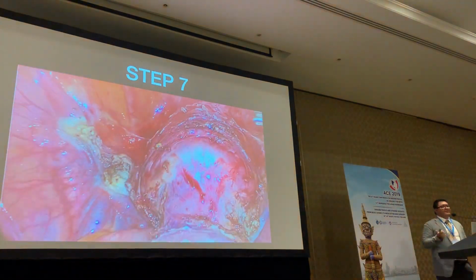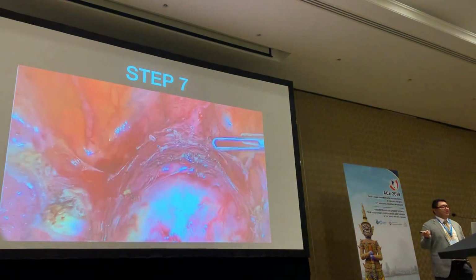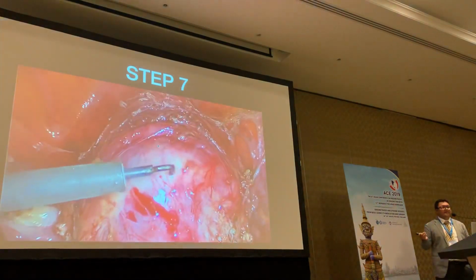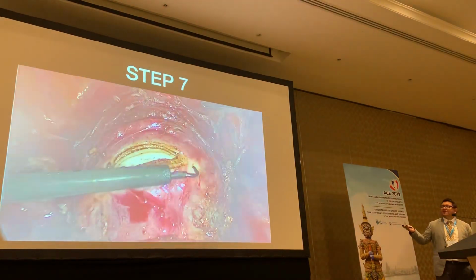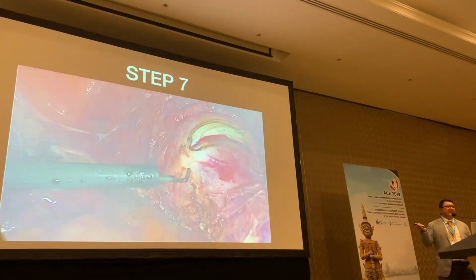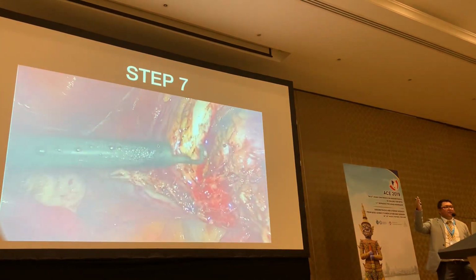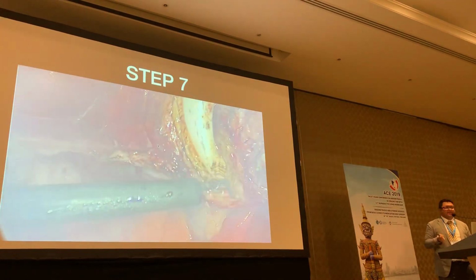So the previous speaker mentioned that there's dehiscence, so it depends on what energy source you use. Of course, the best energy is no energy, but we don't like bleeding in laparoscopy, so the next best thing is a monopolar or a pure cut. I believe the harmonic is better, but I'm not going to open a harmonic just to do a colpotomy. So the next best thing would be a pure cutting monopolar current, which, if you use correctly and quickly, is going to be akin to almost a cold blade. So this is going to reduce your chance of dehiscence, and you don't need to cut it in one fell swoop. You need to cut it in layers, especially if there's a thickened vagina.